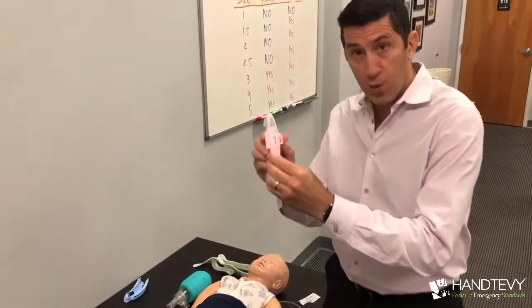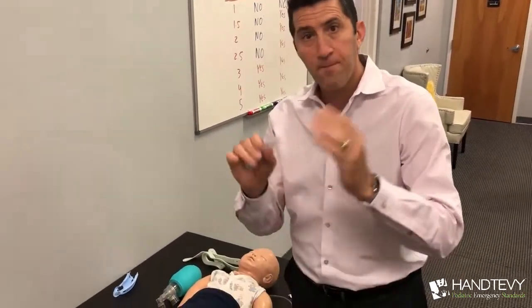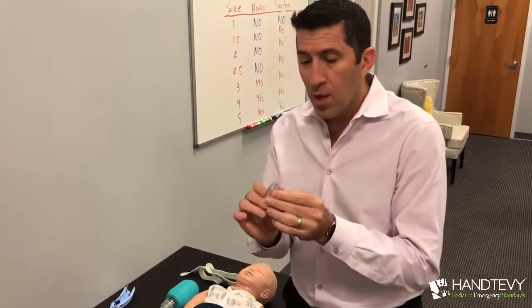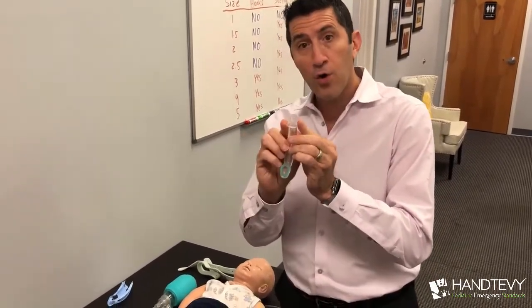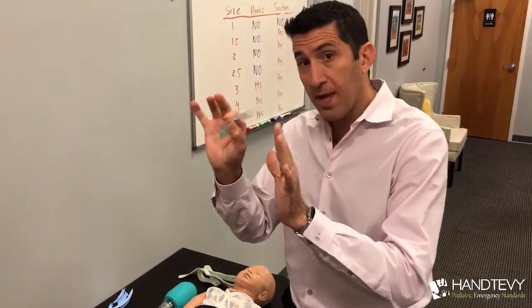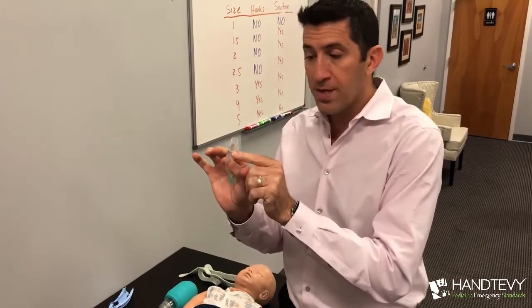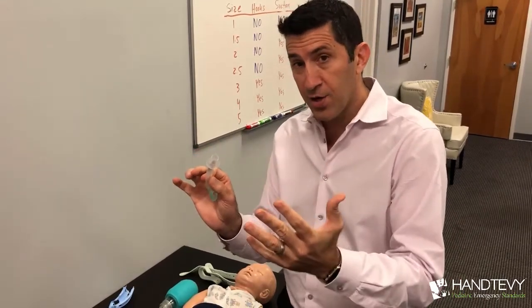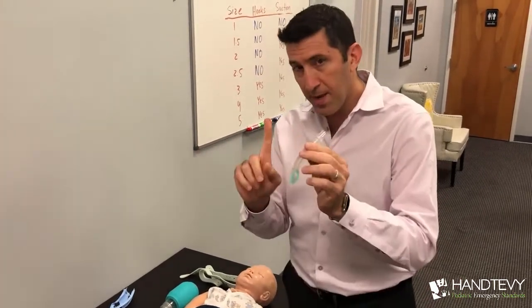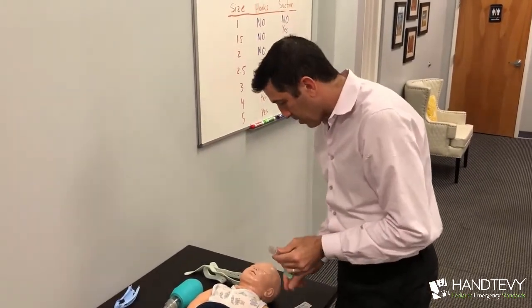Now let's move down to the smallest one — size 1. Remember, this is for a preemie or a newborn only. You can see that there is no suction port and there are no hooks. This is really the most basic of the i-gels. It doesn't have those two items, nor does it have that passive oxygenation port. We'll talk about that in a minute.